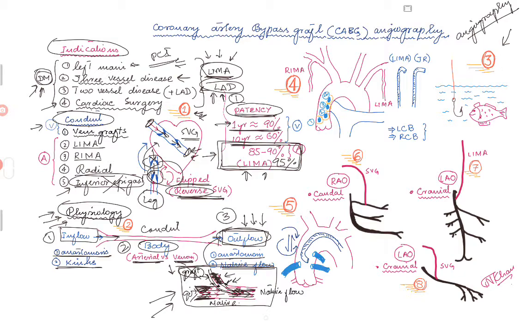What I wanted to stress is, in the cath lab, when we are doing diagnostic or interventional procedures, including PCI, we always say, when you are doing a coronary angiogram, you need to know the anatomy, you need to know your equipment, your catheters, your technique, because you don't just fish around for the coronaries, because the longer you stay in the coronary circulation or inside the body, there are more chances of complication. So that is for diagnostic cardiac catheterization or the PCI.